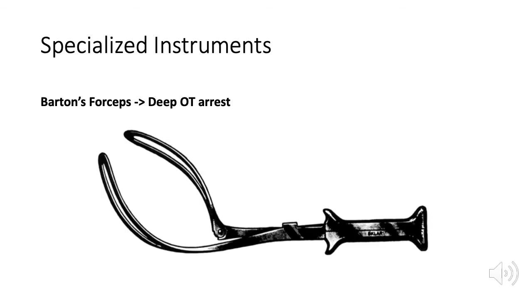Barton's forceps are the instrument of choice when there's a deep transverse arrest in a platypoid pelvis. This is because usually you have to deliver the fetus in an OT position.